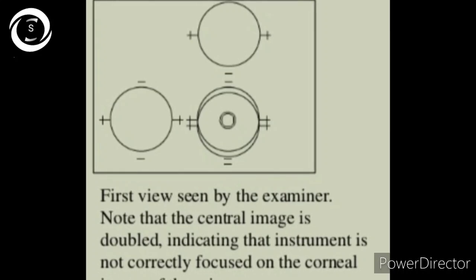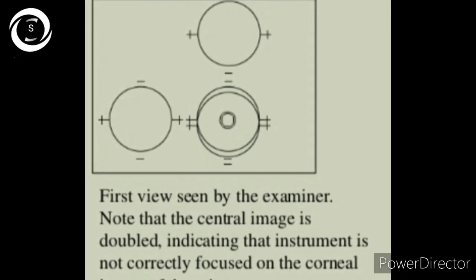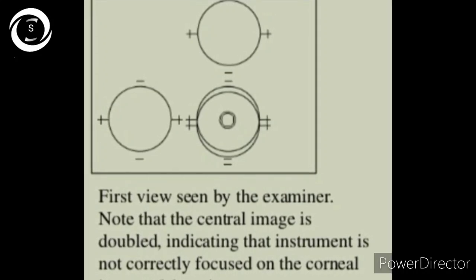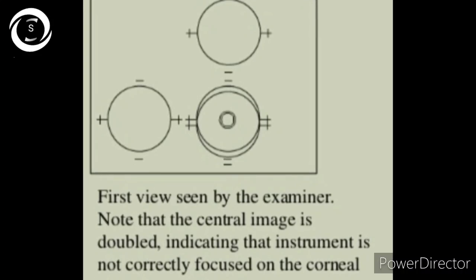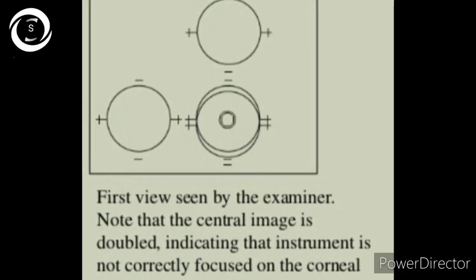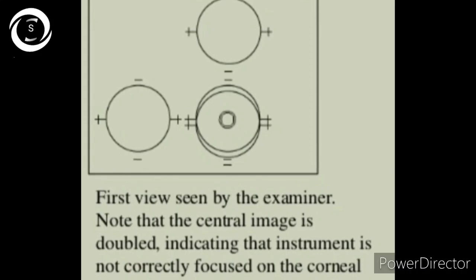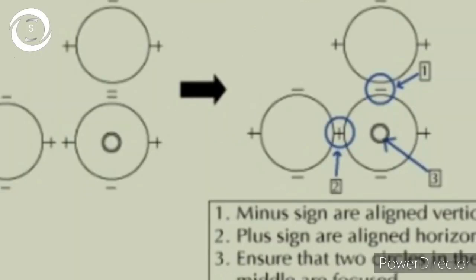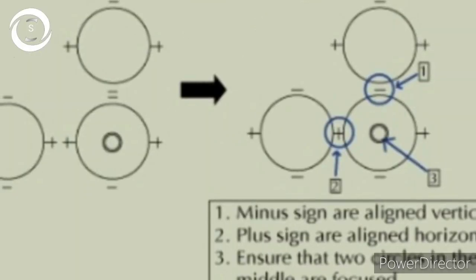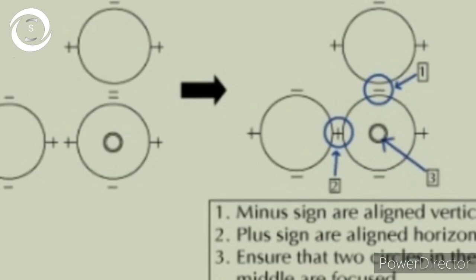If the central image is doubled, it shows the instrument is not correctly focused on the central image of the mire. So first focus the central image. When the image is properly focused, the minus sign is aligned vertically.